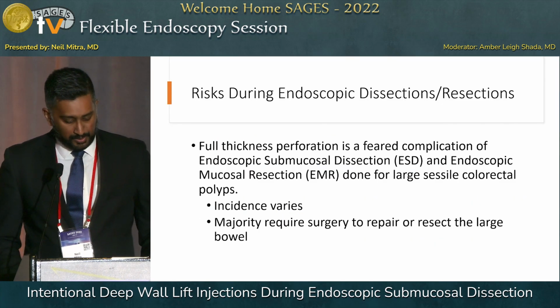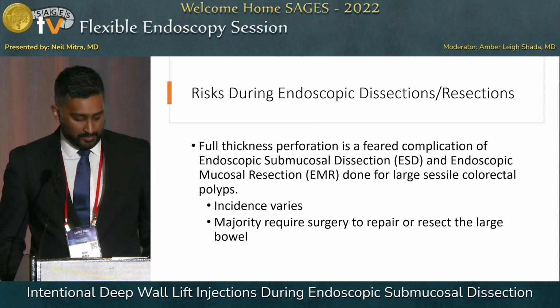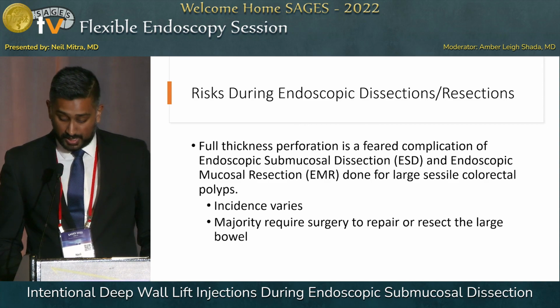Full-thickness perforations are a complication that can occur when performing ESD or EMR. When they occur, surgery is usually required to repair or resect the large bowel.